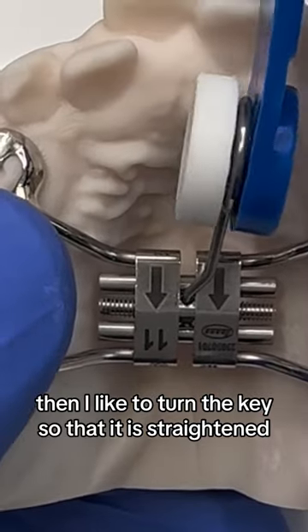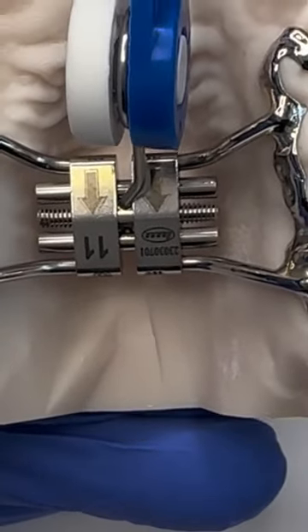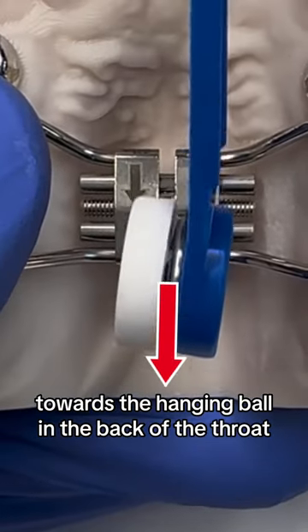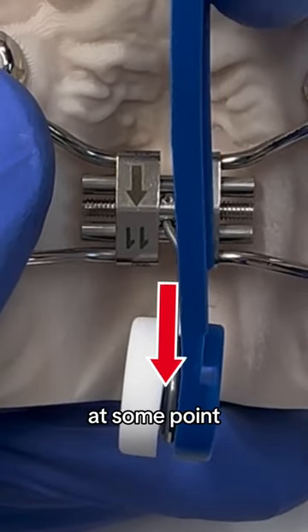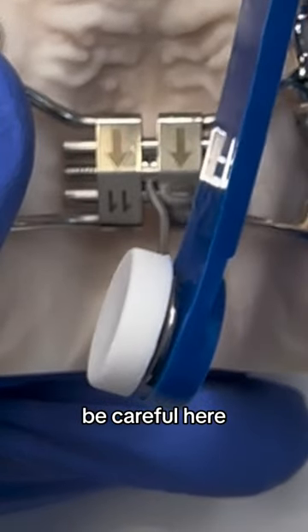Then I like to turn the key so that it is straightened and shoots out the front of the mouth. Next, gently apply backward pressure towards the hangy ball in the back of the throat. At some point the expander will stop you from turning, and that means you've made a complete turn. Be careful here.